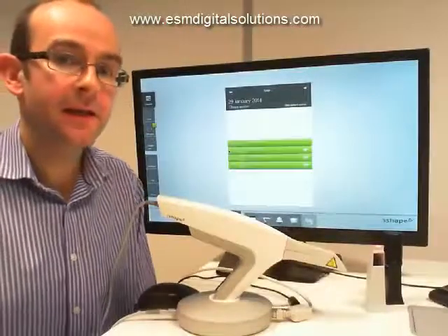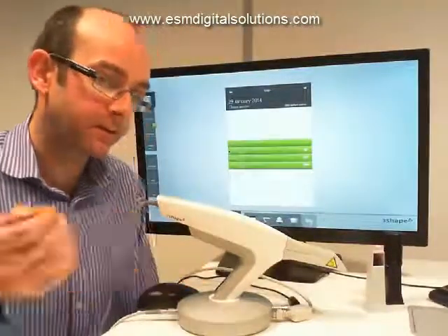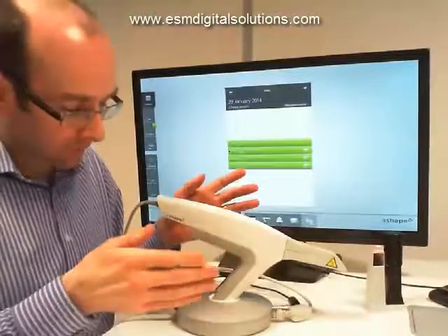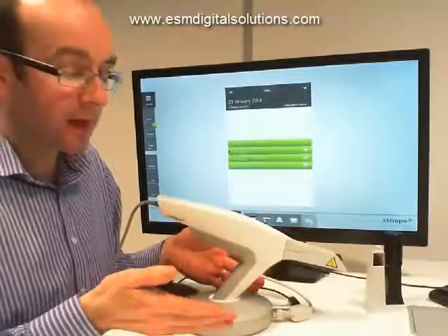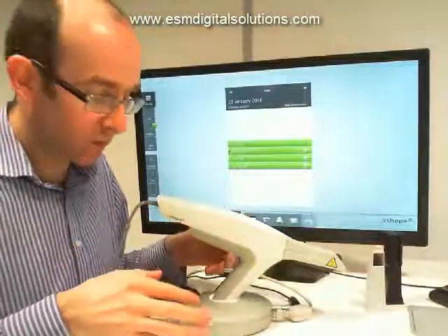Hi and welcome to another ESM training video. In this clip I'd like to introduce you to TRIOS. TRIOS is a three shapes intraoral scanner and it's available in two forms. We've got TRIOS pod, which is what we're looking at here, and we have TRIOS cart which you may have seen on websites and various brochures.